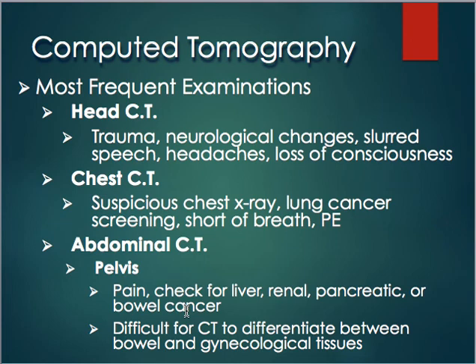The most frequent exams for CT are head, chest, and abdomen, pelvis. So abdomen, pelvis are usually combined a lot of times. So there's differences, obviously, but chest, head, and abdomen are the three most common, but abdomen and pelvis are usually combined together. So the number one most common is the head CT.